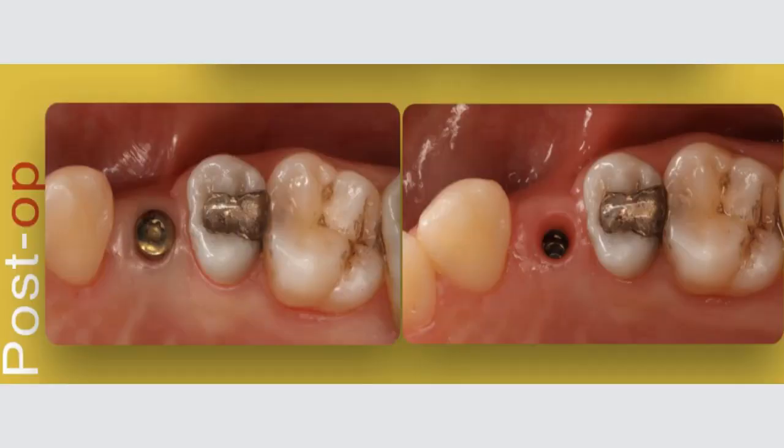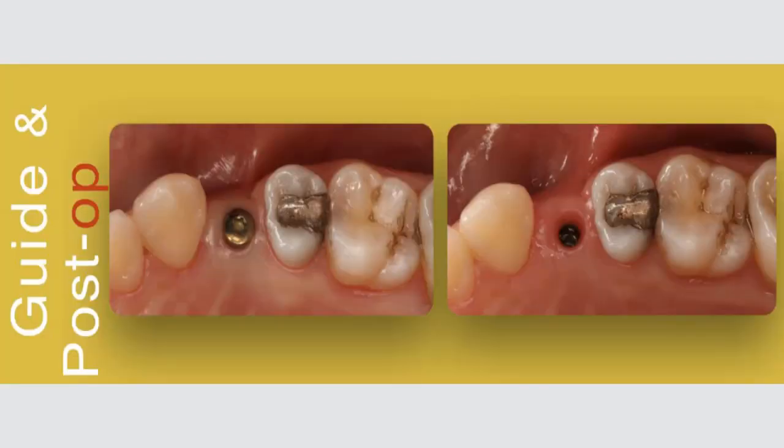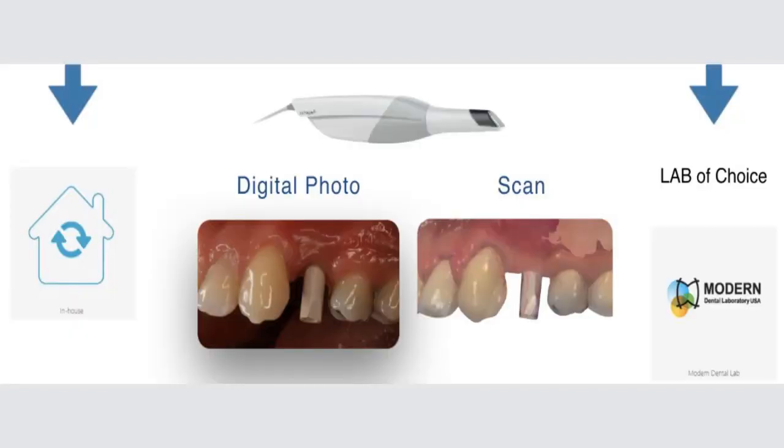The implant is in place. Then you go for the restoration. I have already shown that for the restoration, we use scan flags, single units for restorative work using implants. It's very simple, straightforward. I would go for a bridge as well, but we still have some difficulties when you have a fully edentulous patient. With a fully edentulous patient, if you're trying to do a hybrid, I would wait a little until the whole scanning method improves from one end of the arch to the other.